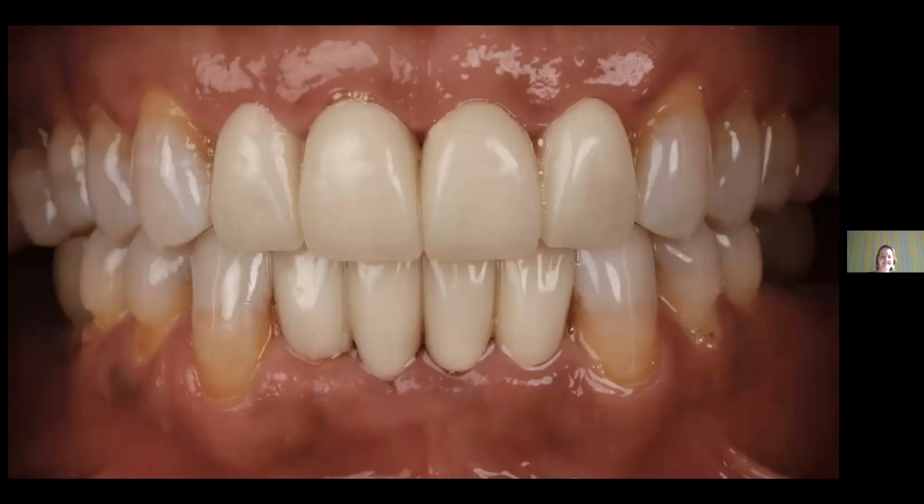Okay, so all we need to do is take a new impression, and the ceramic restorations can be adjusted to the final position of the soft tissue without new preparations. So if we're doing horizontal preparation, we'd have to re-prep these teeth. So this is a big problem.